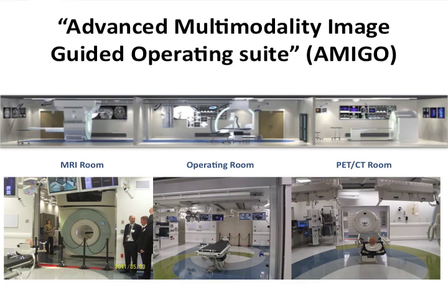The MR scanner was installed by IMRIS. It's installed on rails, so it's actually moving around. It can go all the way to the surgery table. For people on the tour tomorrow at Brigham, we'll get a look at that. These days, they're doing cryoablations and brain surgeries in there, among other things.